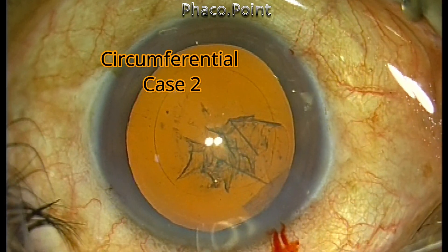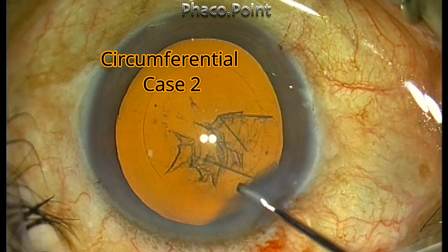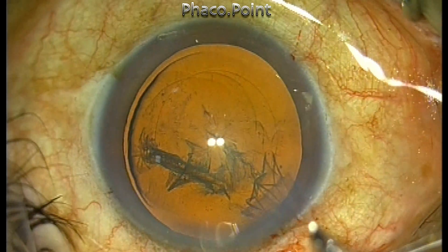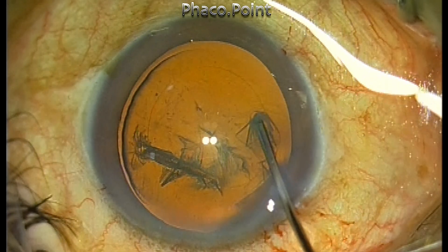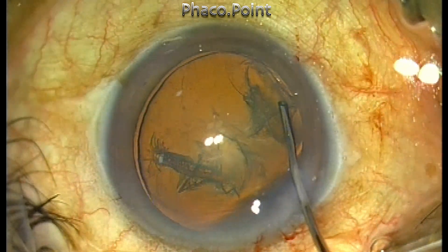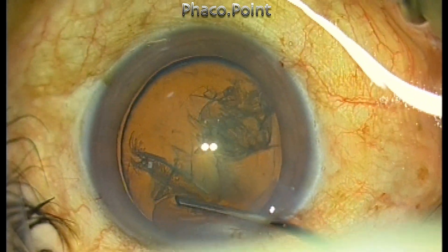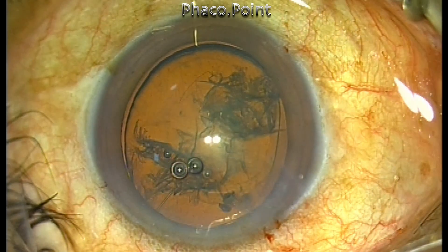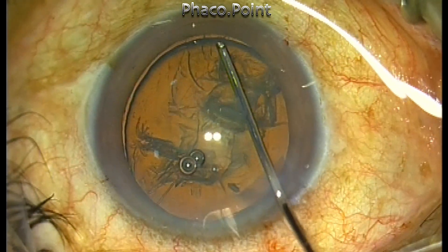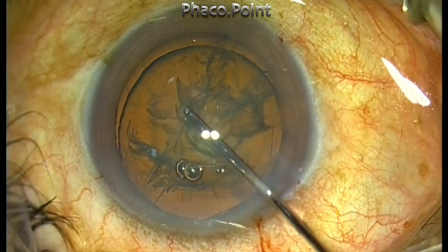Let's take another look at the circumferential technique of hydro delineation, the most commonly performed approach. Go to the mid periphery, hitch the cannula into the substance of the nucleus until you encounter mild resistance, then inject short bursts and small aliquots of fluid to delineate the circumferential edge of the endonucleus. After you are done, you can perform the cortical cleavage hydro dissection.